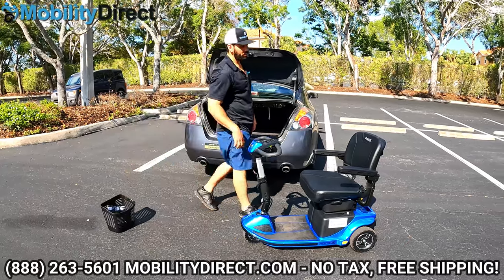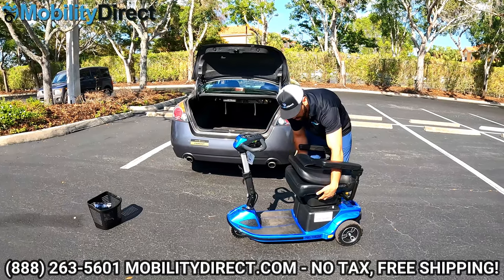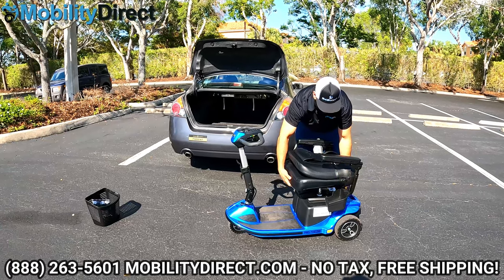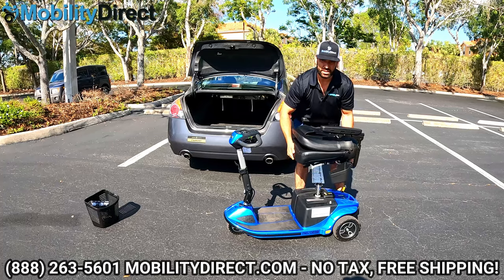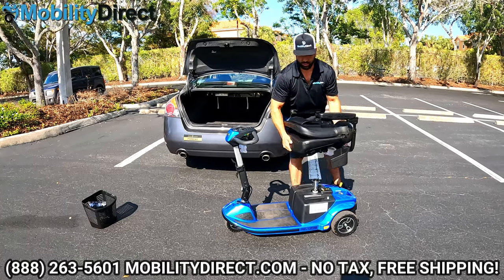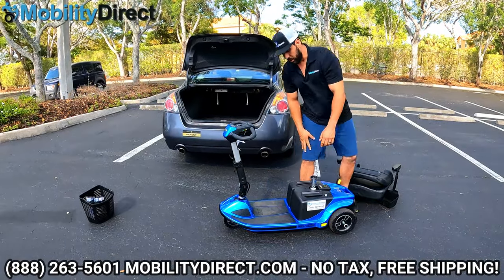The first thing I like to do is grab the seat and fold the backrest down. On this model, you do need to open the under-seat storage bins in order to remove the seat. Once they're open, you can just pick straight up. Avoid tilting in any direction when lifting the seat, or it'll seem like it's stuck and won't come out easily.